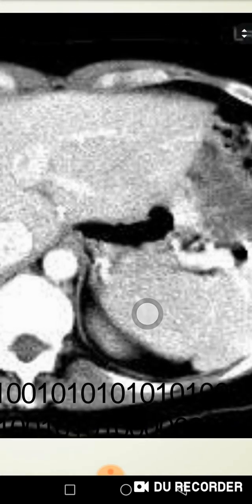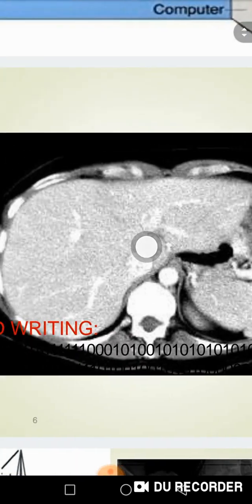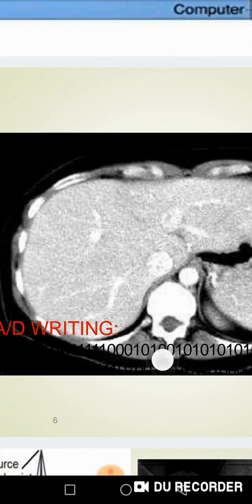On the other hand, this particular part here contains air, and this section comes from the stomach, which appears black because the air does not absorb any X-rays. The absorption is weak, so the radiation reaching the detector in this area is very high, which appears black. In other areas, it takes on a gray color, like here in the muscle tissue. The X-rays are absorbed, but not with the same intensity as in the spine, so they start to appear gray.